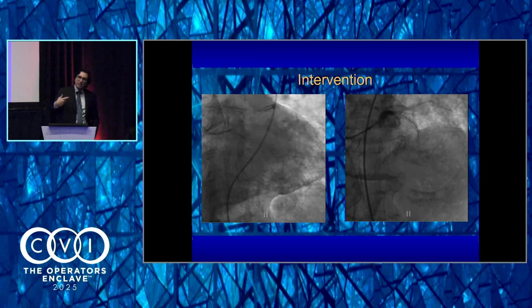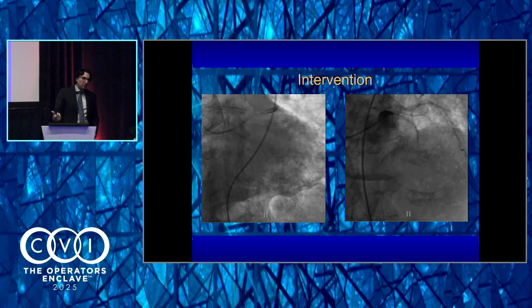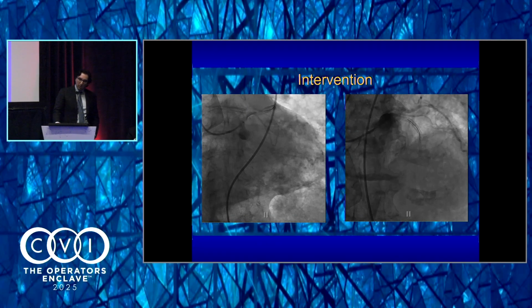And at this point, the patient's not doing well. He's now becoming more hypotensive. He's on one pressor, and we're giving boluses of phenylephrine to keep his pressures up. And I can't get the wire any further down.